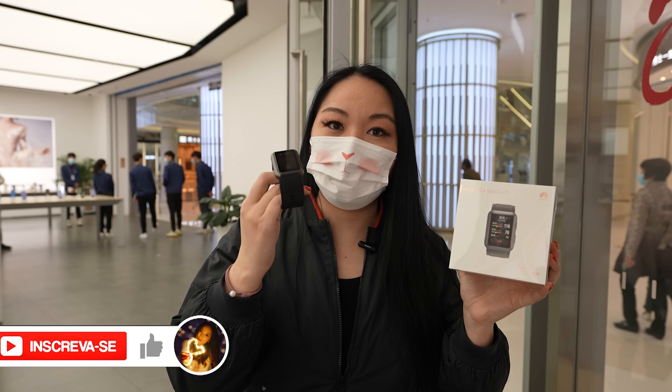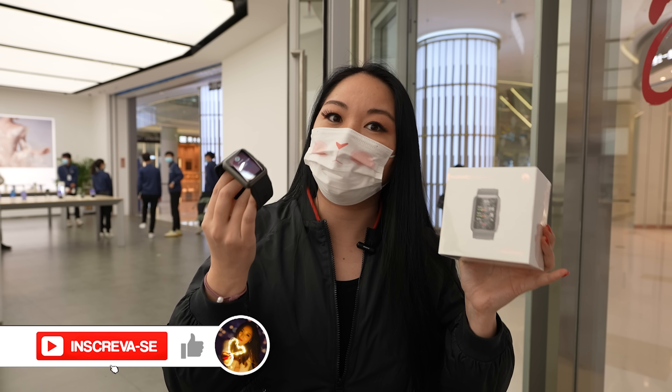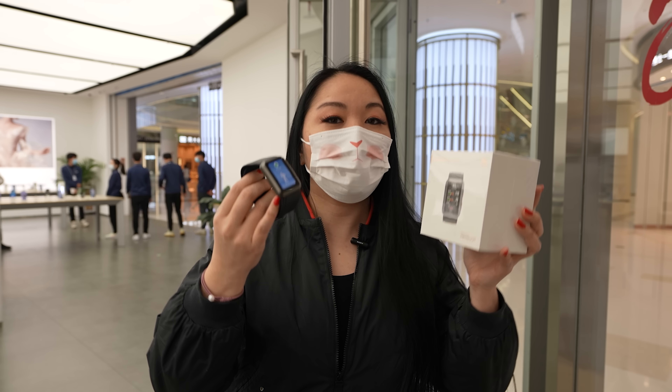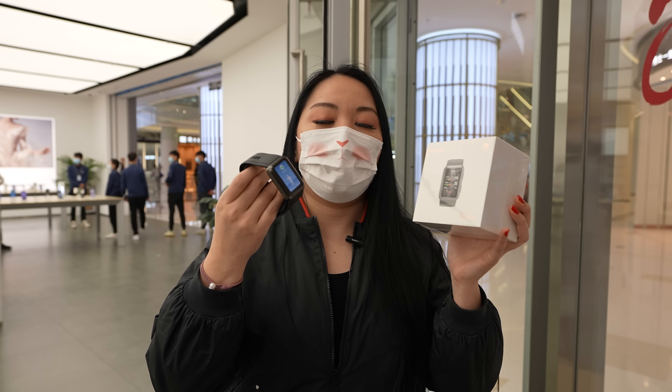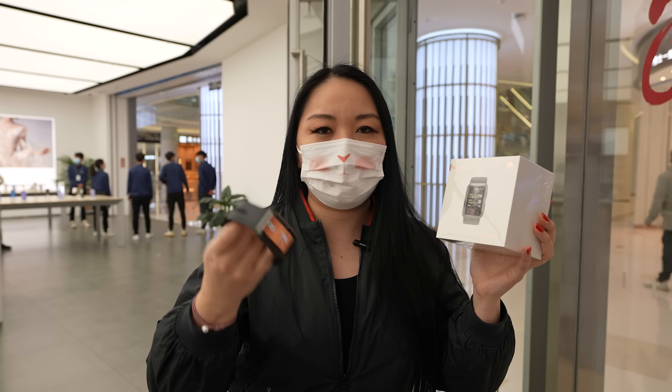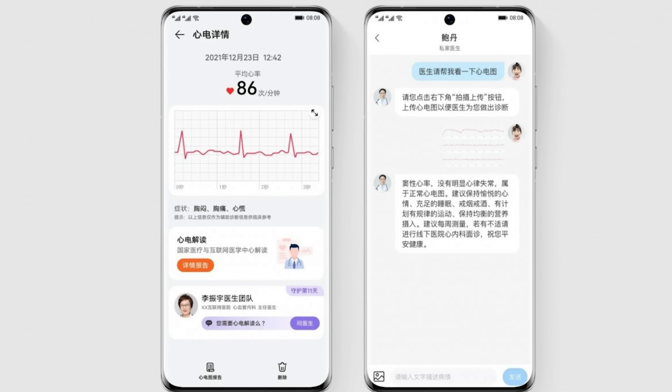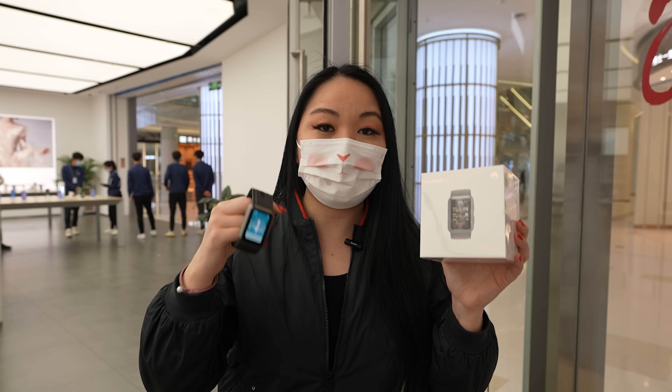This one you can really use as a medical device, different from other smartwatches. It has an interesting function where you will be able to connect your health data, electrocardiogram, sleep data, and send it directly to the doctor. But it seems that this service is only available here in China.